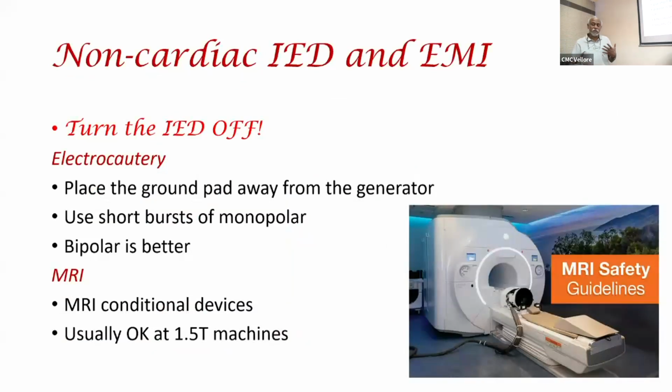So you see there's a whole lot of implanted electronic devices which are not cardiac related. And if they come for any surgery or procedure, the general thing is turn them off. Because unlike a cardiac device, which you can't turn off, because life does not depend on this, you can control all the other things like sleep apnea or epilepsy. All this under anesthesia can be controlled. But the cardiac thing, of course, you can't turn it off. So this one, turn it off if you can. And again, the same principles, beware, don't put the pad close to the generator and try to use bipolar whenever you can.